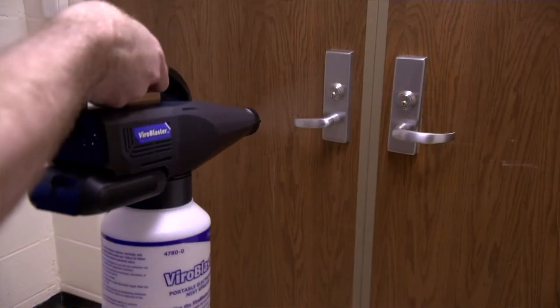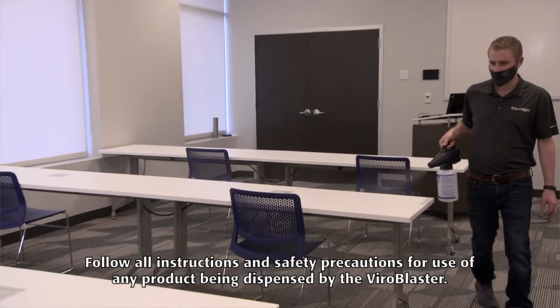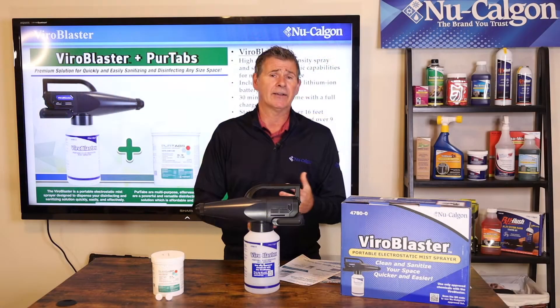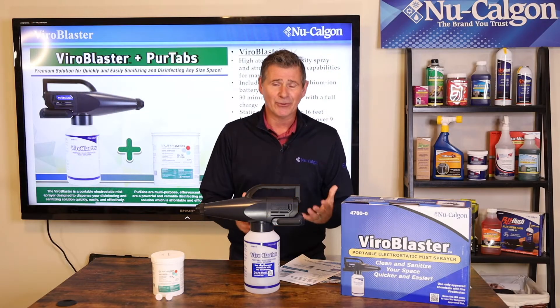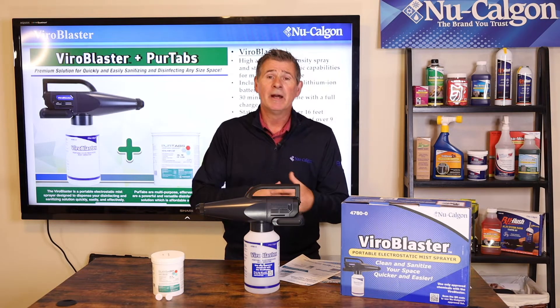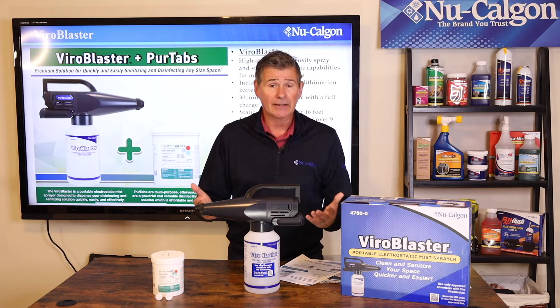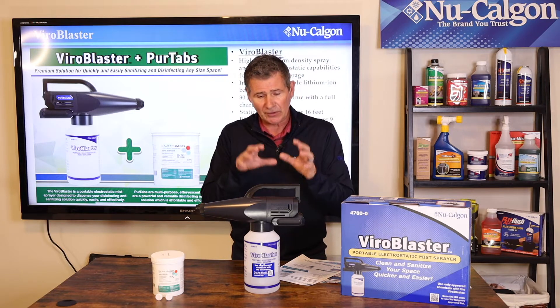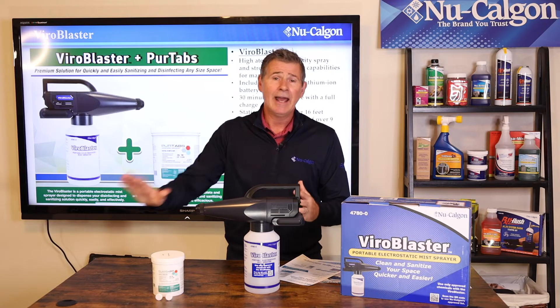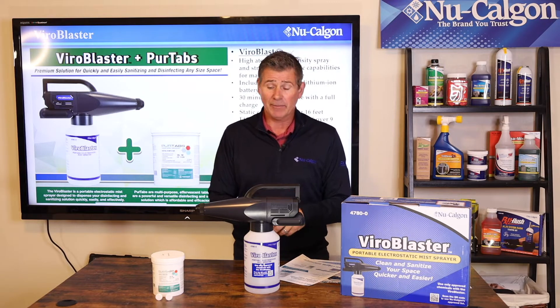This is going to allow somebody to simply walk through a classroom and mist down the hard, non-porous surfaces to sanitize and disinfect them, rather than walking through with a spray bottle, spraying down a desktop, wiping it down, and moving on to the next. You just walk through, mist everything down, and leave. The electrostatic mist clings to those surfaces — just let it dry and you're good to go. No need to go back and wipe anything down.